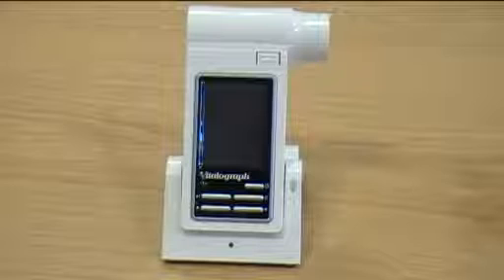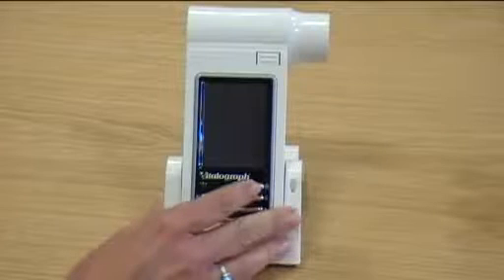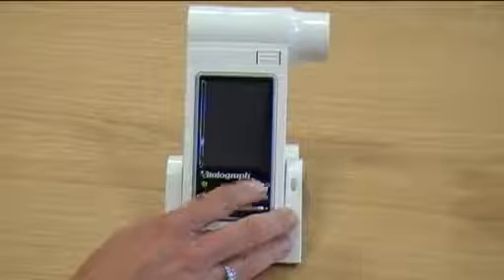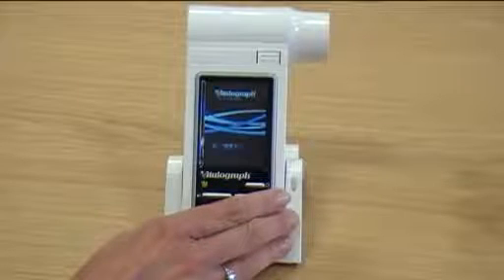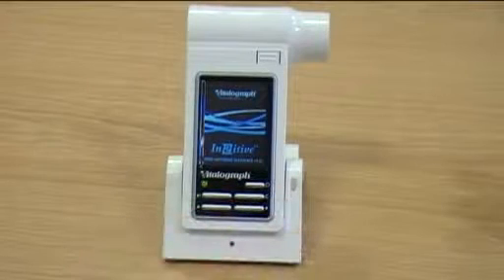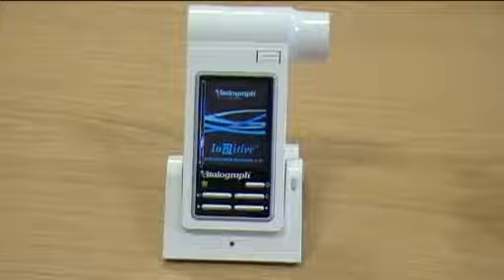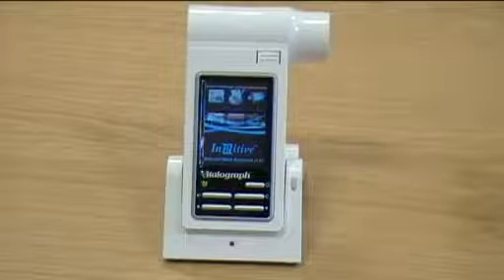To switch on your Intuitive, you need to press the on button on the device. This will bring up the main menu and will show the icons on your main menu.